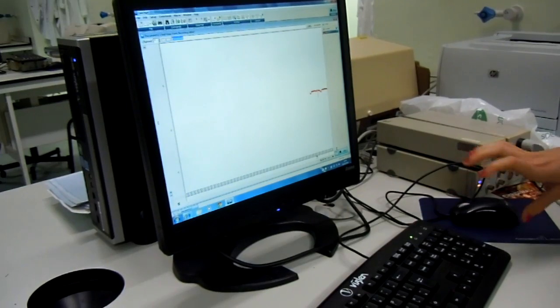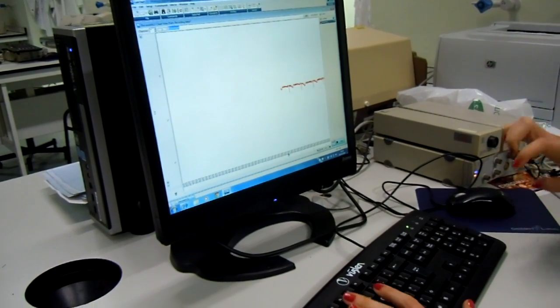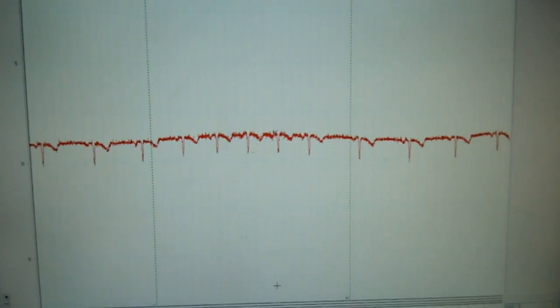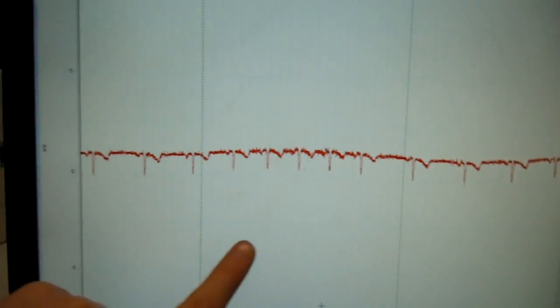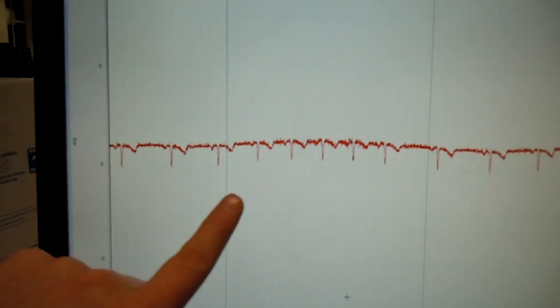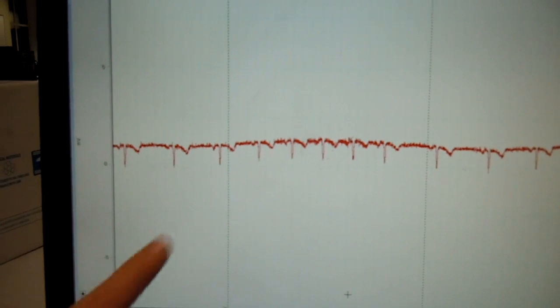We're now going to repeat the procedure, but Rachel's going to be breathing in for four seconds and out for four seconds with the use of a stopwatch. You'll be able to see a very pronounced respiratory sinus arrhythmia over this way of breathing. Here, expiring and then inspiring, you can see the change between the QRS complexes being further apart and then much closer together when inspiring.